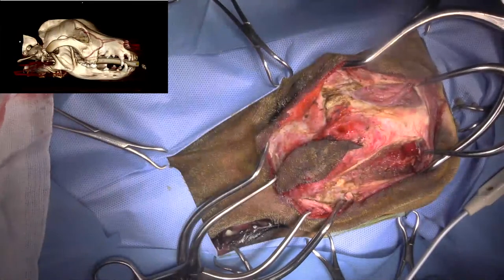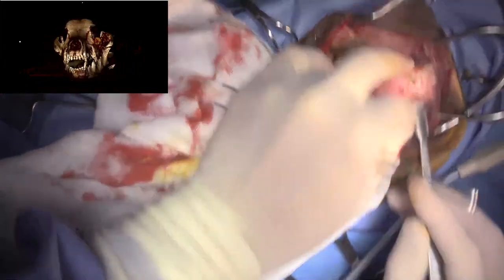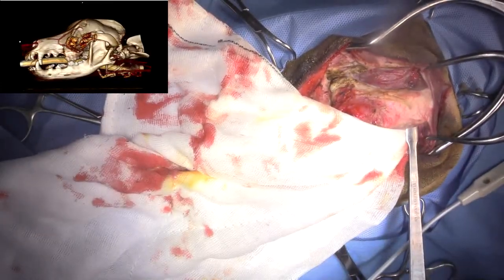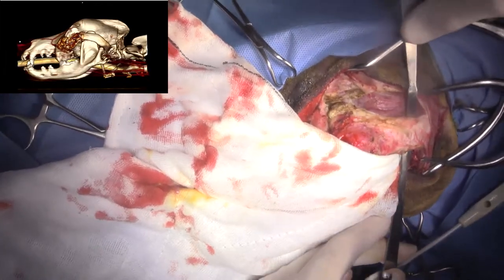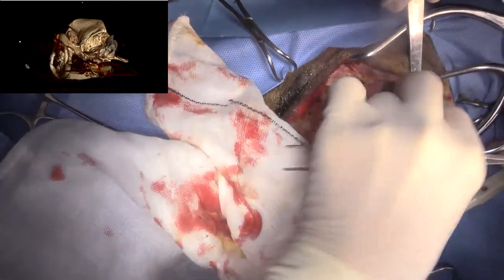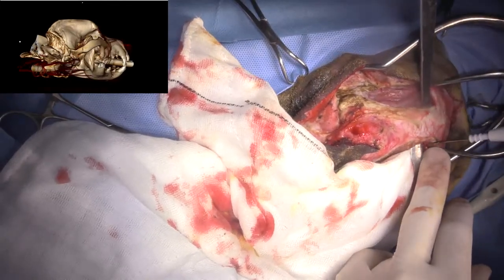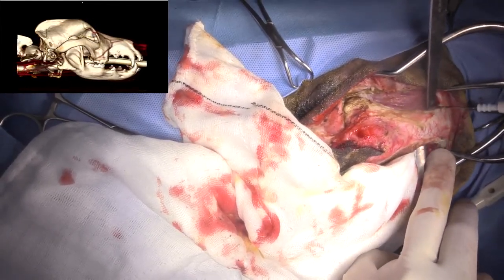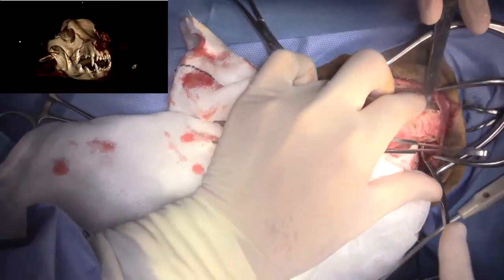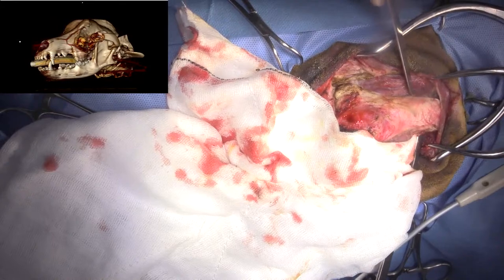Question about how far the osseotomy margin should be? With fibrosarcomas, I like to get a couple of centimeters margin, because they are pretty invasive on the face, particularly. Okay, so I've got a couple of Homan retractors here. And because this is fairly non-functional now that we're cutting through it, there's no reason to preserve any of it, really. So I'm just going to come quite far back here, as long as you don't get into the temporomandibular joint, which is at the caudal end.